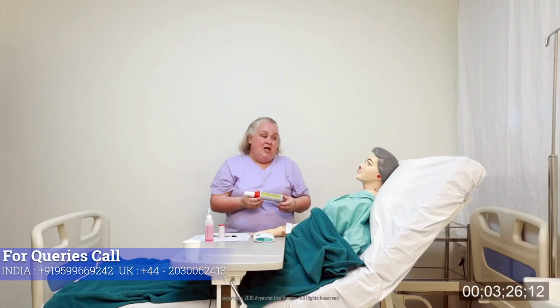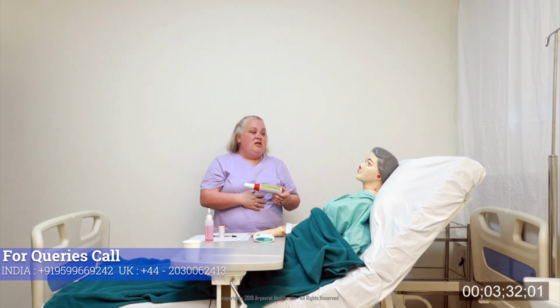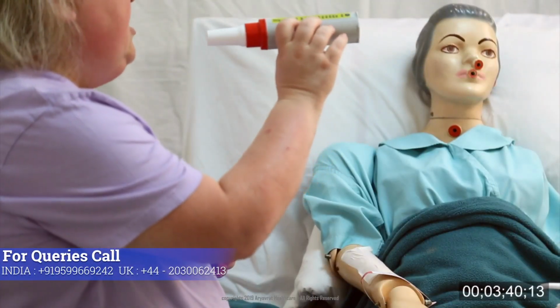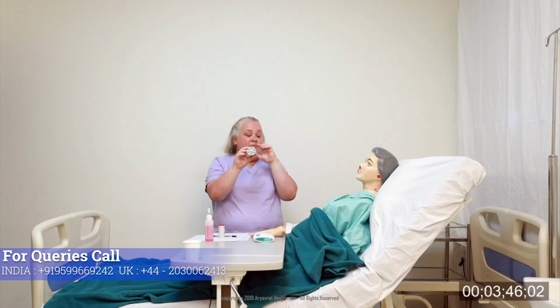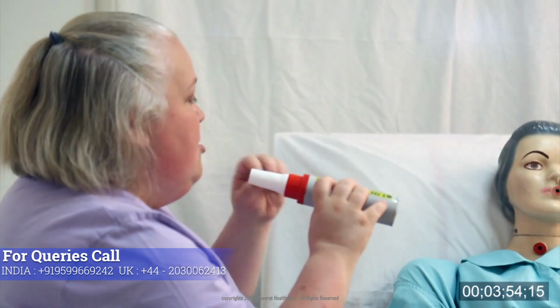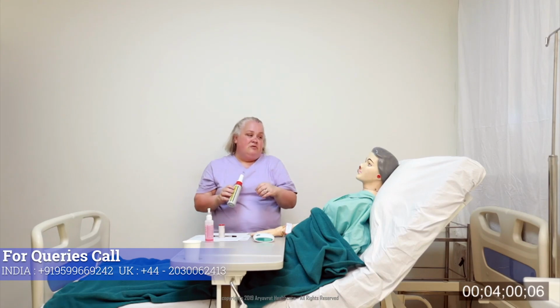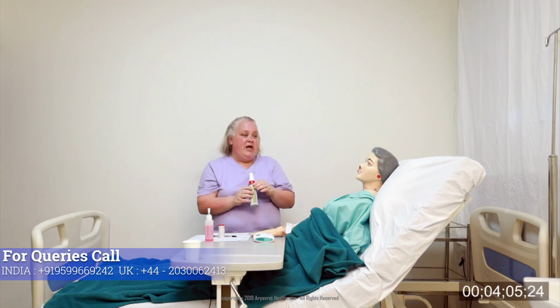The best position to take this in is standing. But if you can't stand, make sure that you're sitting upright and your neck isn't flexed or extended, so a neutral position of your head. You need to hold the device at right angles, so horizontally. You need to take a deep breath in and make a seal around the mouthpiece, making sure that the arrow is back to 0. You need to expel that air in a short, sharp puff. So it's not a long, prolonged puff like you blow in a balloon. It's a short, sharp puff, as hard and as fast as you can.